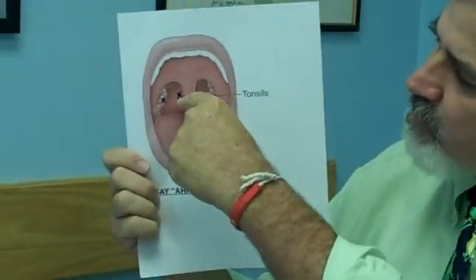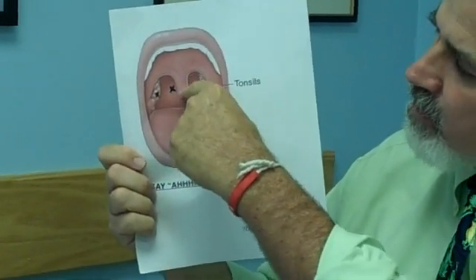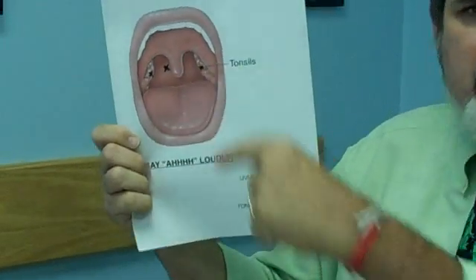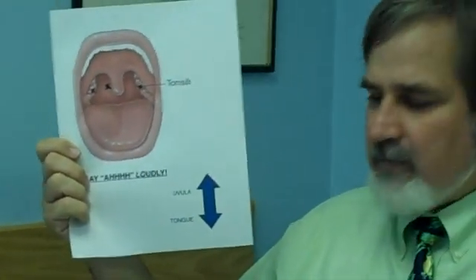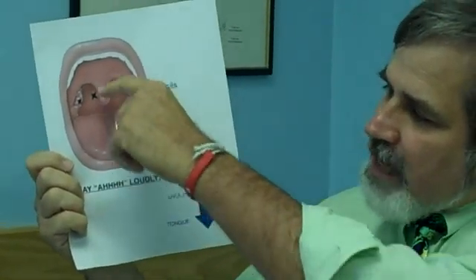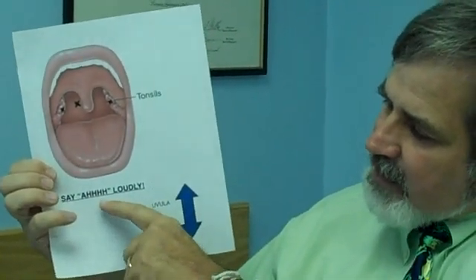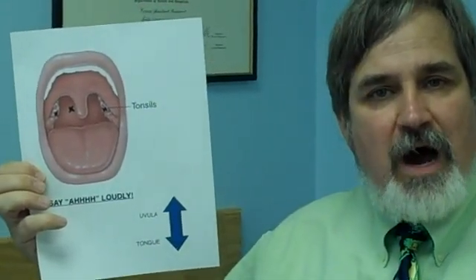The swab is put all the way to the back of the throat, then started to turn — it touches the tonsils once, touches them twice, and then you pull it out. To open the mouth wide enough and see clearly, a child should say something out loud — say a loud 'ah' — and what that does is raise the uvula up and pull the tongue down, allowing space to put the swab in.